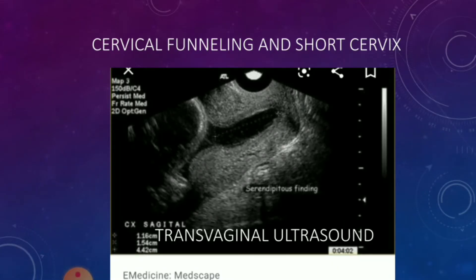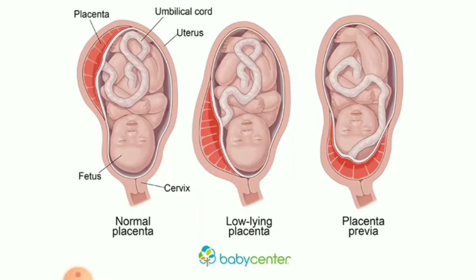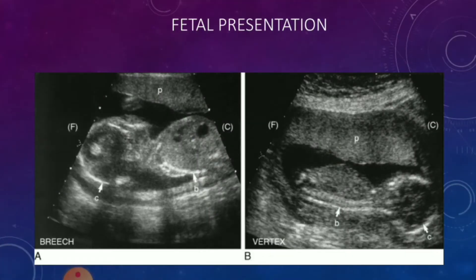Secondly, you want to see the placental lie — see whether it's previa, posterior, fundal, low-lying, or marginal. You also want to see the presentation of the baby, whether it's vertex or cephalic, breech, transverse, or one of those variations.